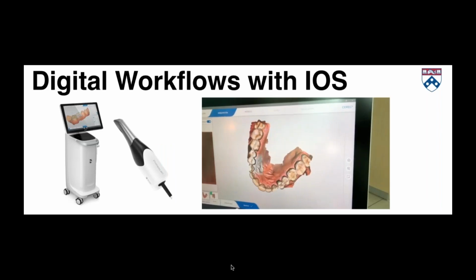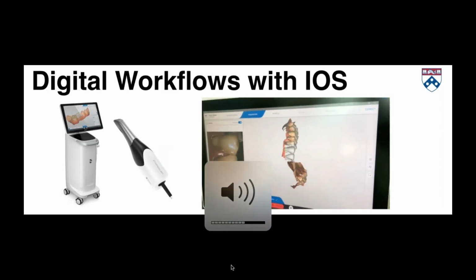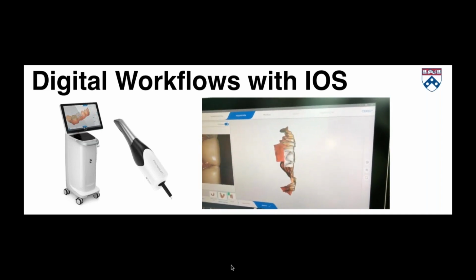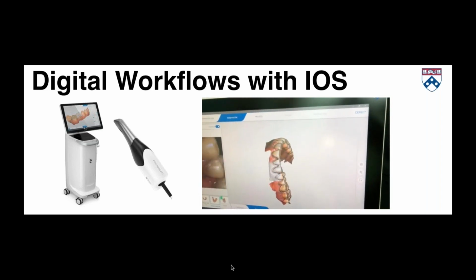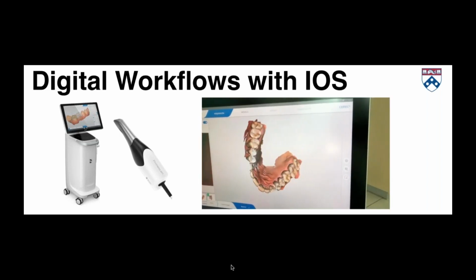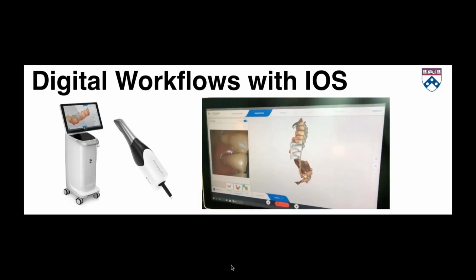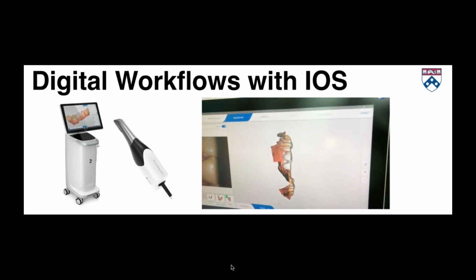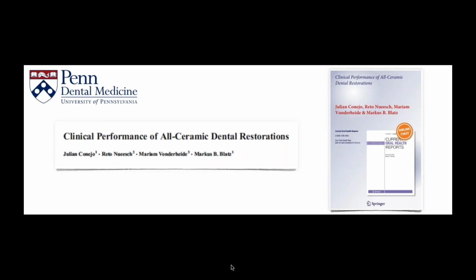Nowadays, we have so many different types of intraoral scanners that whatever case we have, we can just go for an intraoral scan, and it's so easy to share it with different technicians wherever they are in your state, in other states, in other countries, in other continents. So this really opens the number of possibilities with the people that we can start working together and collaborating, and that's something very, very exciting for us.